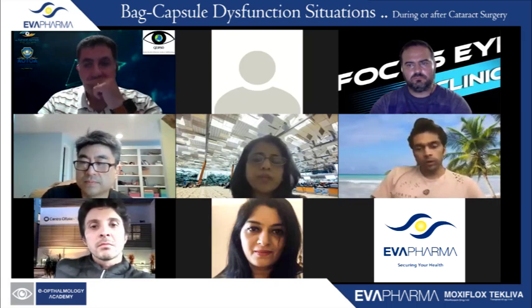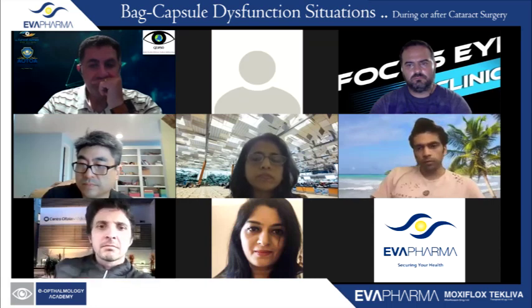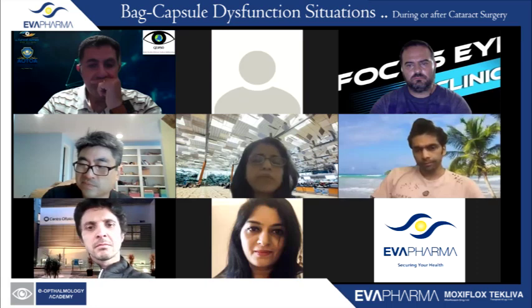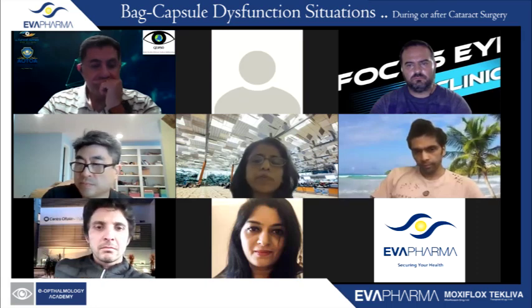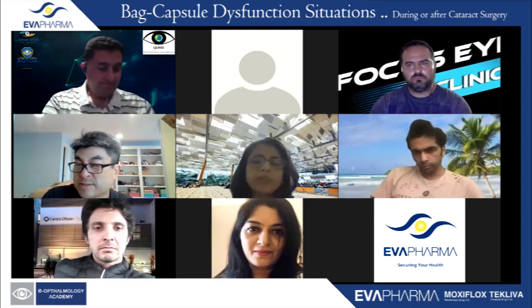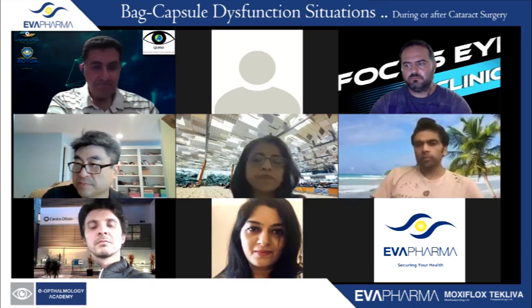And what about intraocular lens power calculation in this? Does it change from the normal glued intraocular lens? Or you could, as Priya had mentioned, bring it down a little bit, but you could also keep it the same. It's up to you. Normally, you could decrease it by about half a diopter, because you're in a more anterior plane.